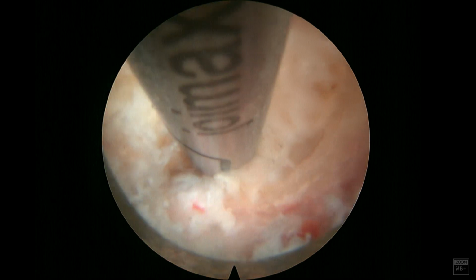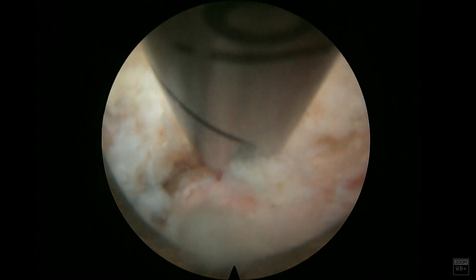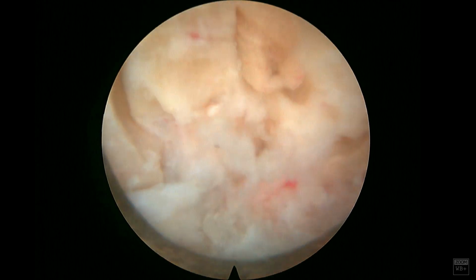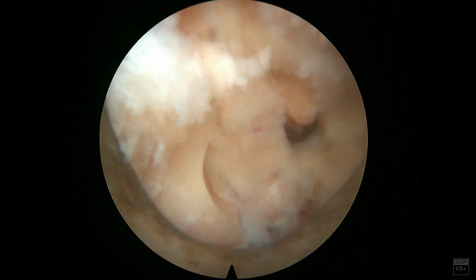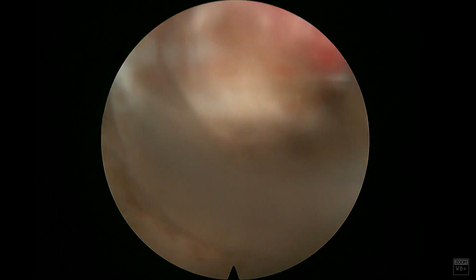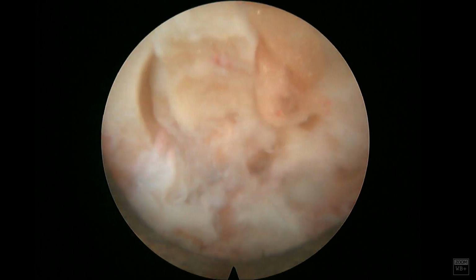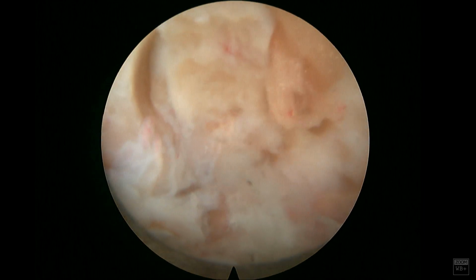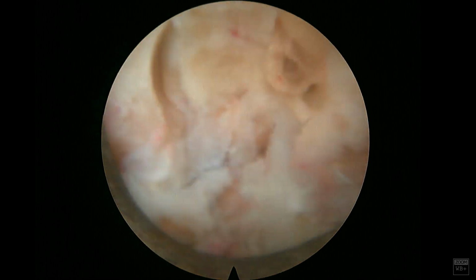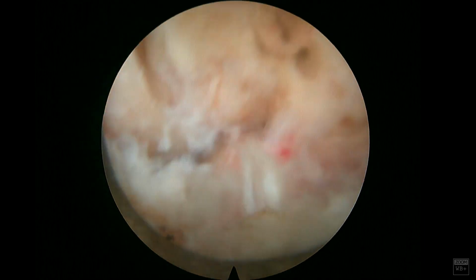And so you saw that I pushed my camera down there. I was wiping the camera on some of the soft tissue to clean it. Here I'm removing the tissue around the bone, and this is important because you want to make sure that you get a good visualization of the bone when you're using a burr, because if not, then you can stray into the canal, or potentially you get the tissue wrapped up and it just takes a little bit more time to see what you're doing. So here I've extended the decompression to the superior lateral aspect of the L5 lamina.